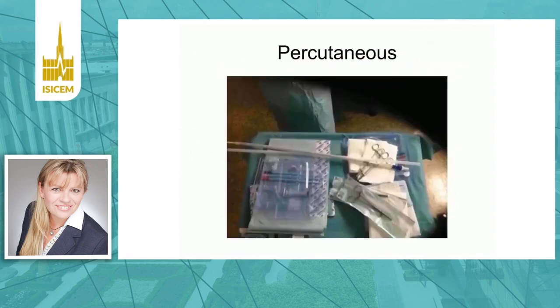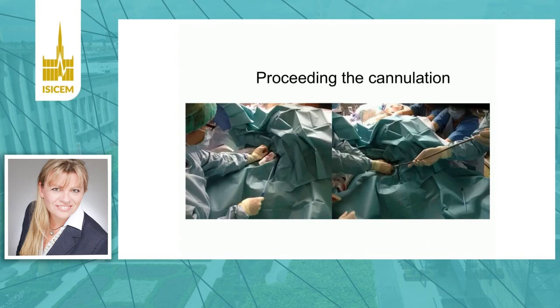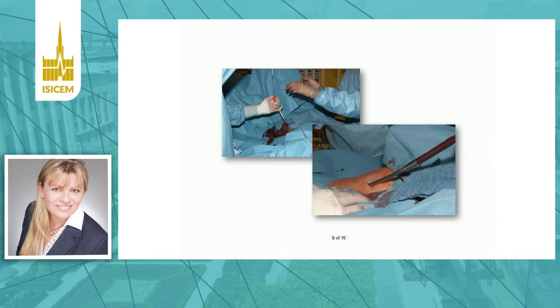This is what we need for percutaneous cannulation and how to prepare it. This is the whole procedure. We need some dilators, the wire, and some assistance from people who can help us around. This is how the cannula is introduced over the wire, and it's the Seldinger technique. About the visualization of the cannula, there will be some following slides.